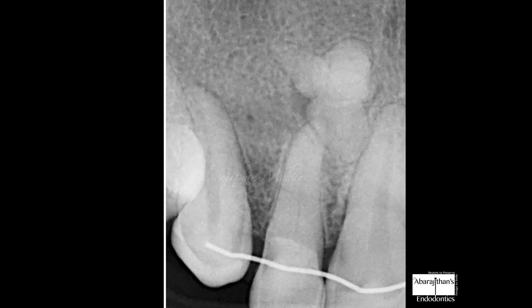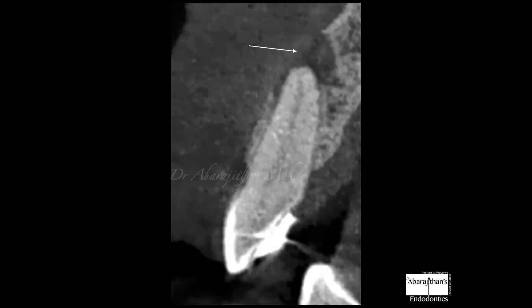Coming back to our case of discussion — we have this lateral incisor and there is a lesion, but the confusion is whether the lesion is originating from the tooth or from the odontome. That is why I prefer to go for a CBCT in this case, whereas I am not recommending CBCT for all calcified cases.